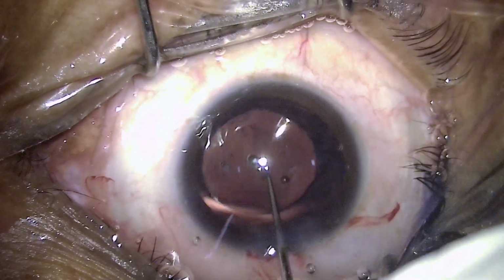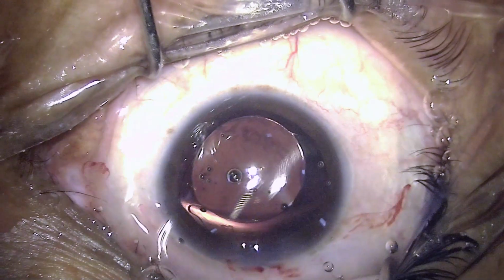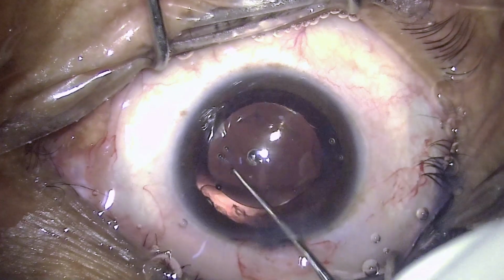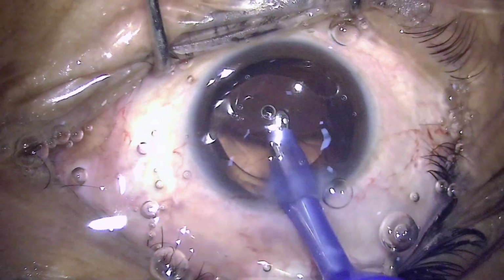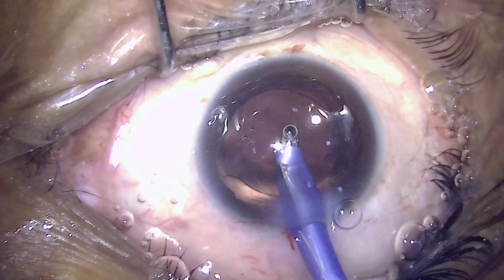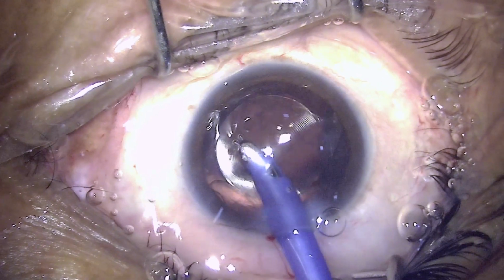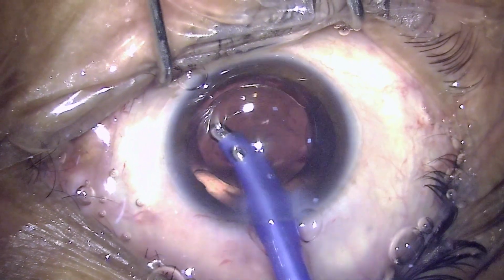It's interesting to see that a patient who was wanting such a premium IOL had waited for so long with this handicap of the vision and got the surgery done later on when the eye had a nearly white mature cataract and vision was limited to PL PR. This is usually a rarity, and now performing an opposite clear corneal incision just to relieve the pre-existing corneal astigmatism, and this is one of the effective and cost-effective ways of managing corneal astigmatism. Just by placing an opposite clear corneal incision can take care of corneal astigmatism of something like 1 diopter.